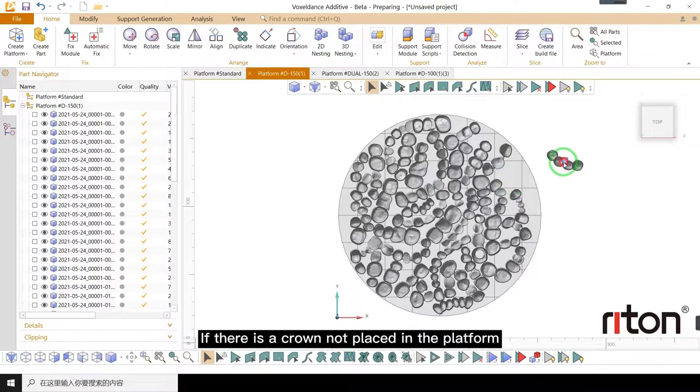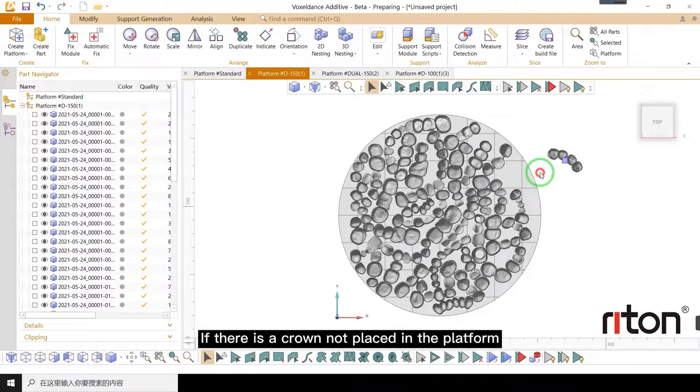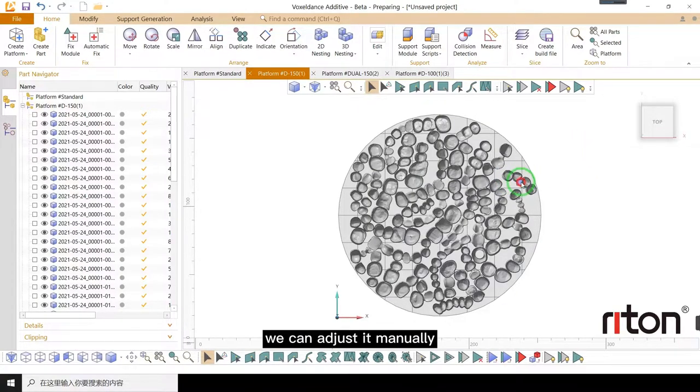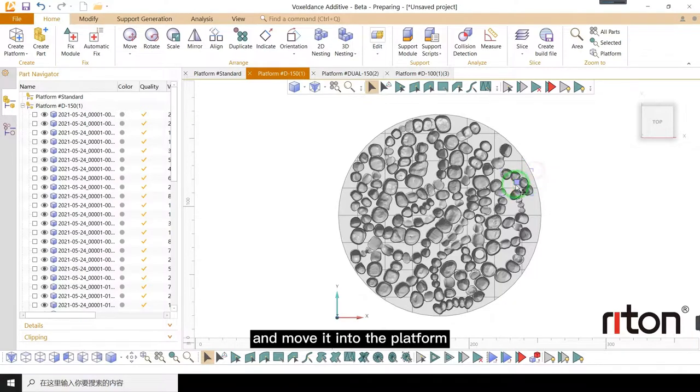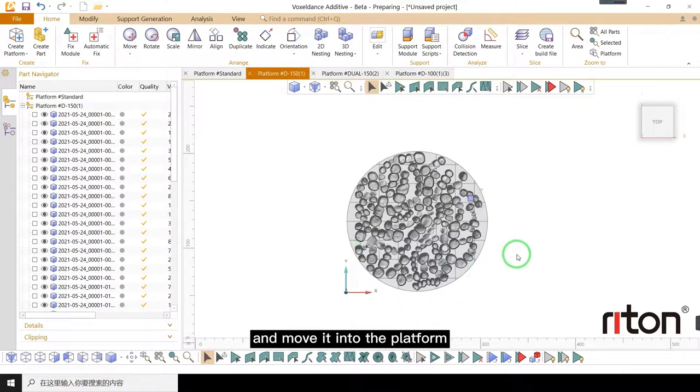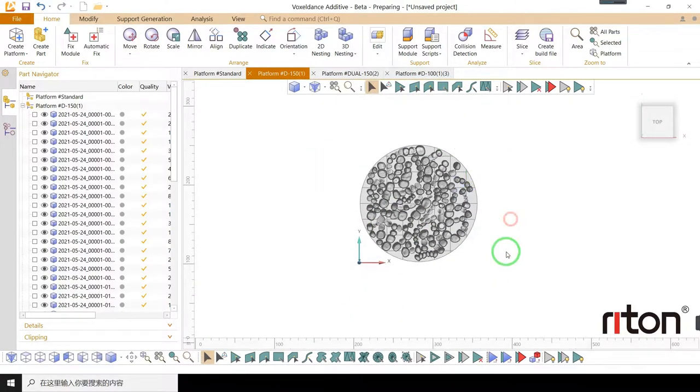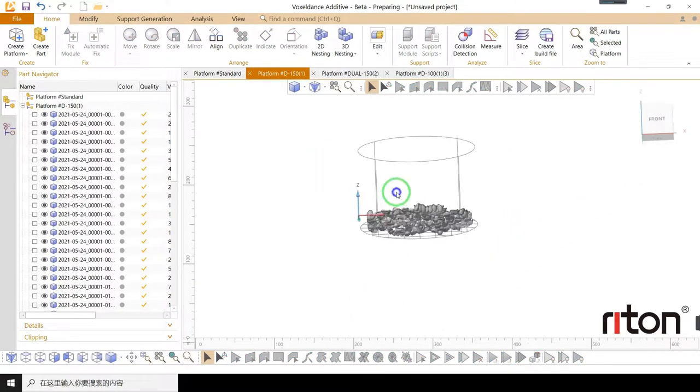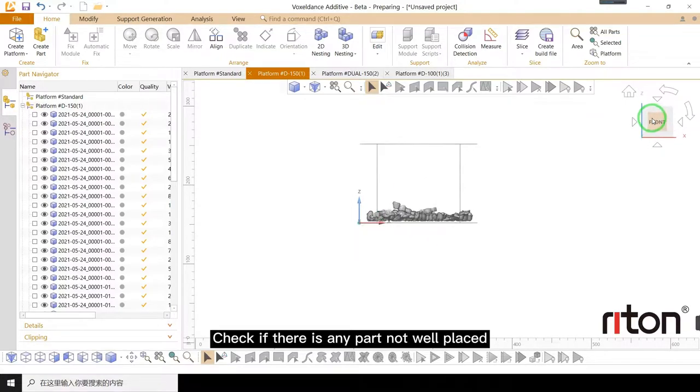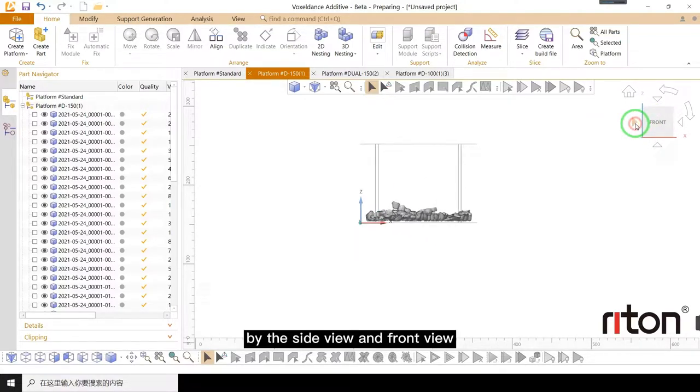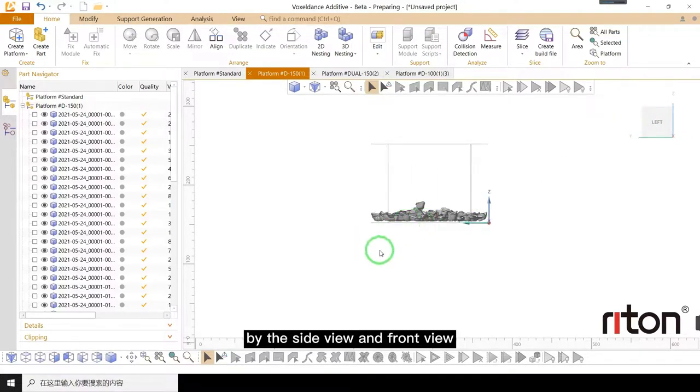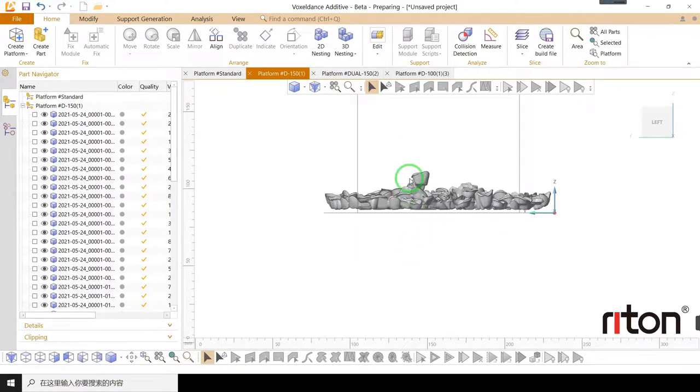If there is a crown not placed in the platform, we can adjust it manually and move it into the platform. Check if there is any part not well placed by the side view and front view.